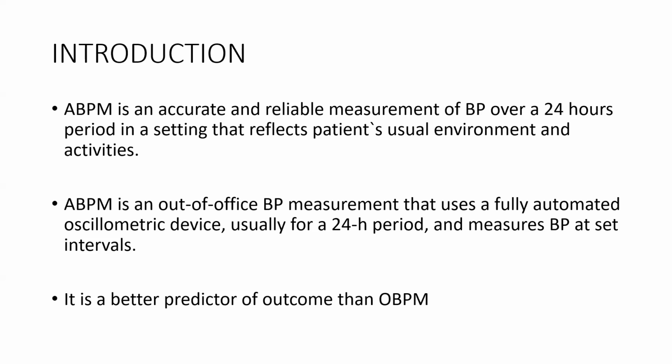It is noted that it's a better predictor of outcome than office blood pressure monitoring. The advantage is that it gives greater reproducibility of 24-hour mean blood pressure values.